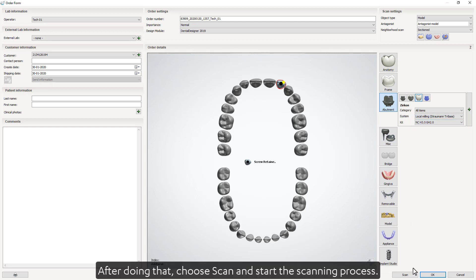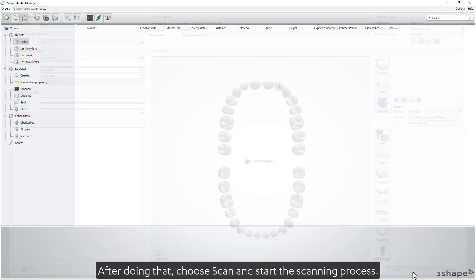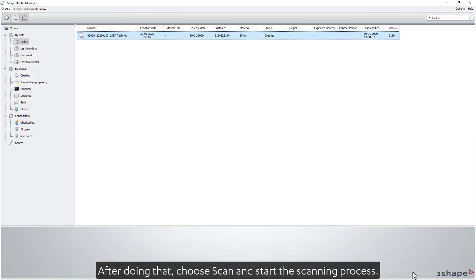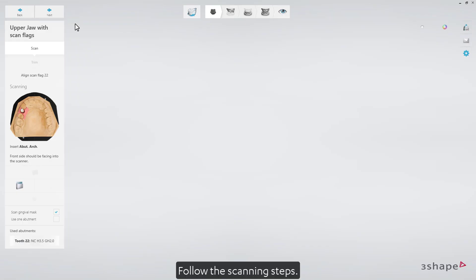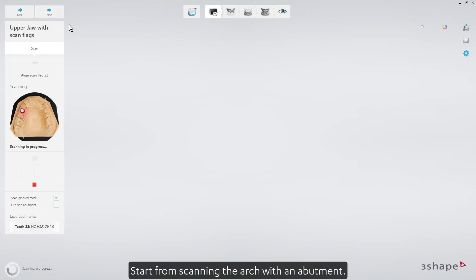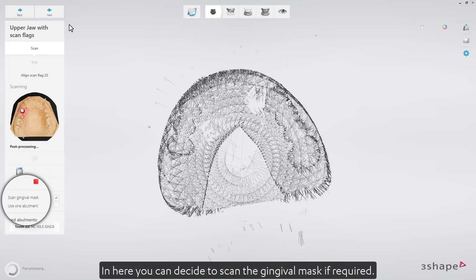After doing that, choose scan and start the scanning process. Follow the scanning steps. Start from scanning the arch with an abutment. Here, you can decide to scan the gingival mask if required.